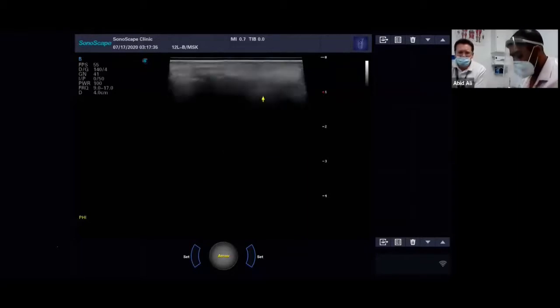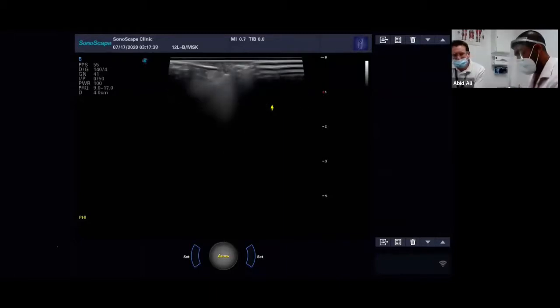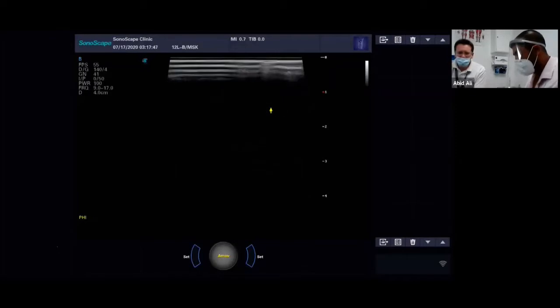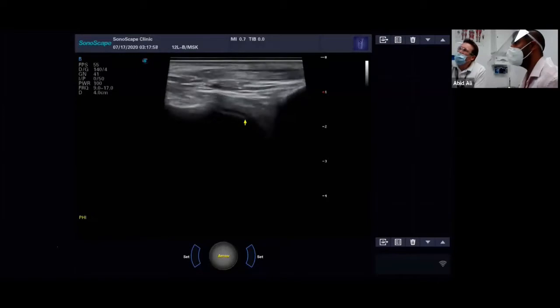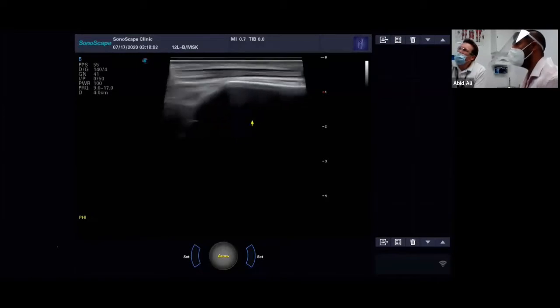Okay, right, let's go back. I'm just going to take the probe off and get some jelly around the area, so it's not drying out. Let's get a little bit more on there. Okay, so plenty of jelly because, of course, it contours here, and you can end up losing contact with your probe because your probe is a straight line. It's not curved, but the ankle is. So plenty of coupling jelly in there so you can make your way around that angle and keep a good image in the picture. So let's come back up to the tibia here.